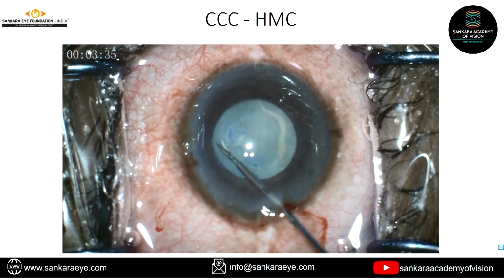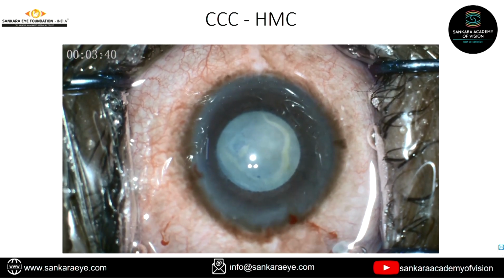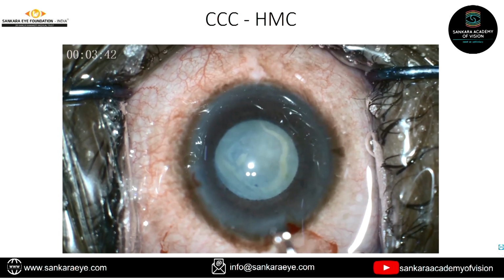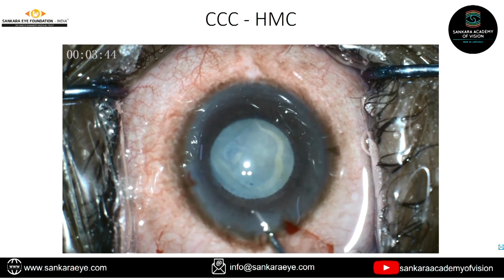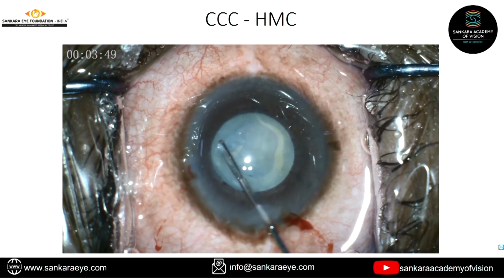So now I use the scissors, 25 gauge scissors, cut the other end, and with the 25 gauge forceps, now I go to the opposite direction with adequate visco in the anterior chamber. So the anterior chamber always has to be deep. So now I hold with the forceps.